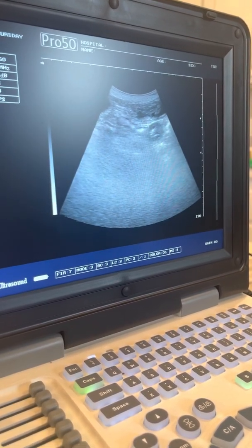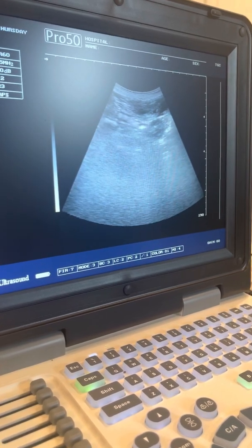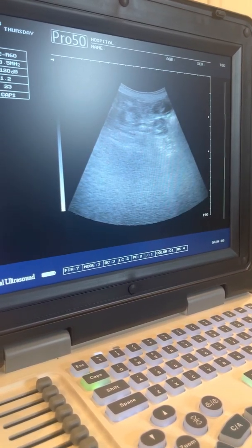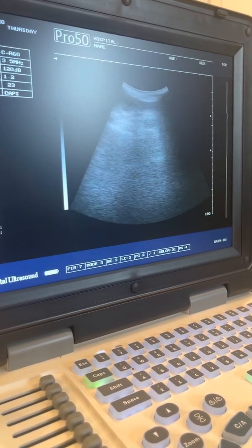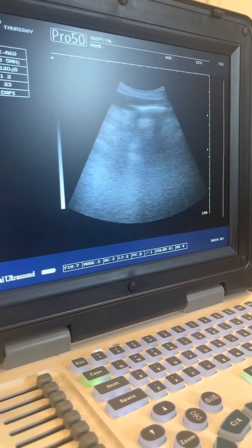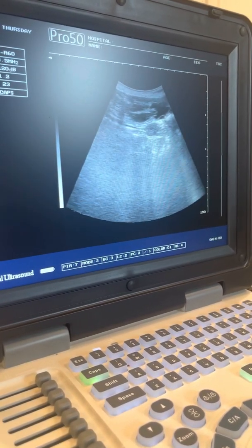You can see that puppy moving in the top right — so cool. After day 28, you're going to get a much more accurate look at puppies to confirm pregnancy. Sometimes you go in before day 28 and you think there's no pregnancy — you just looked a little too early.